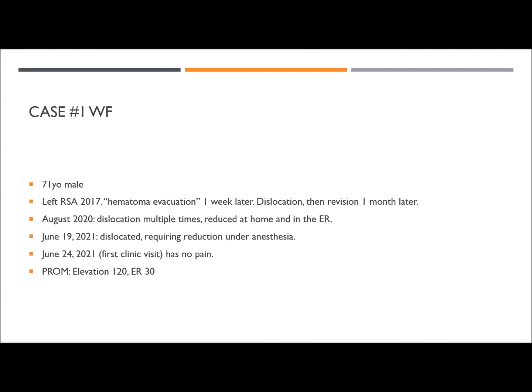And with some of these other designs, if you lateralize the joint, then repairing the subscap becomes problematic in some patients because it tensions the subscap, and so there's not enough length on the subscap to get the normal external rotation that you want out of it. But if you don't fix it, then you lose some of that internal rotation strength. And so lately I've kind of just stopped fixing the subscapularis muscle, and that gives two advantages.